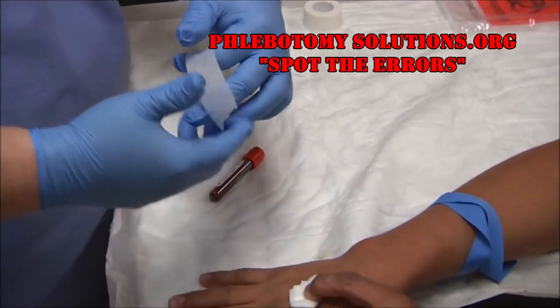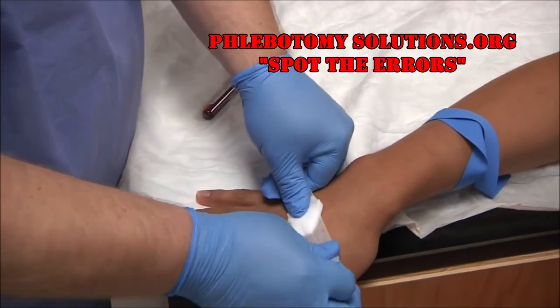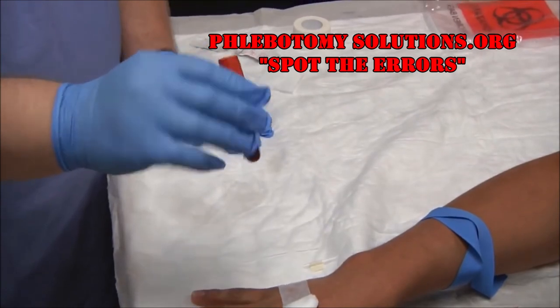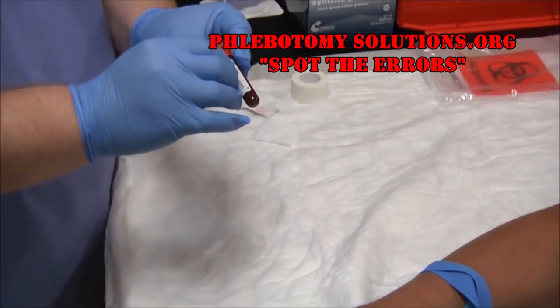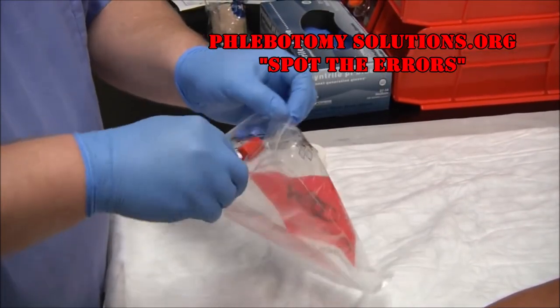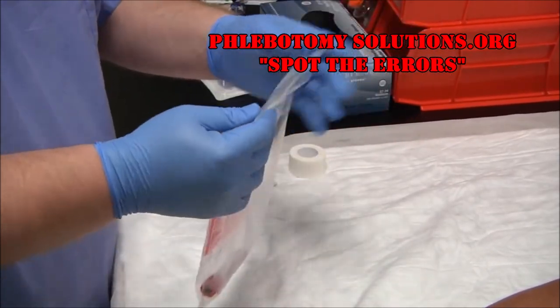Grab your piece of tape and bandage the patient. Invert your tube three to four times, making sure you're mixing the chemicals with the blood. Go ahead and put the patient's name on the tube, today's date and time, and your initials. Then place the tube in your lab bag with the biohazard symbol and transport it to the lab.